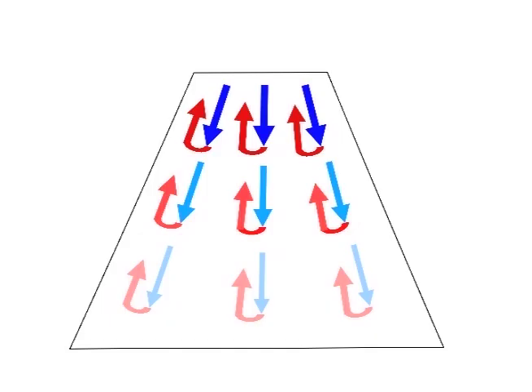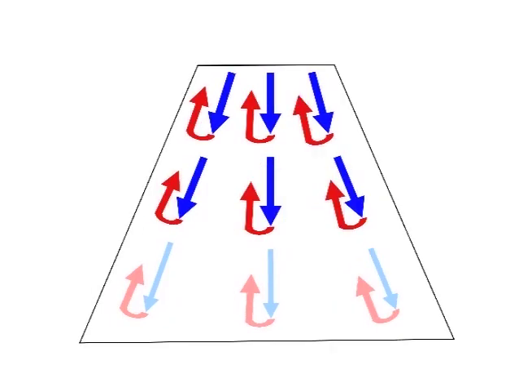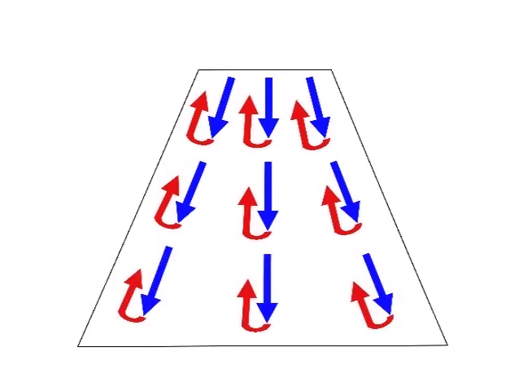We showed that the time gain compensation toggles are used to enhance the ultrasound beam and the reflected return at increasing depths to obtain a homogeneous image in a homogeneous tissue.